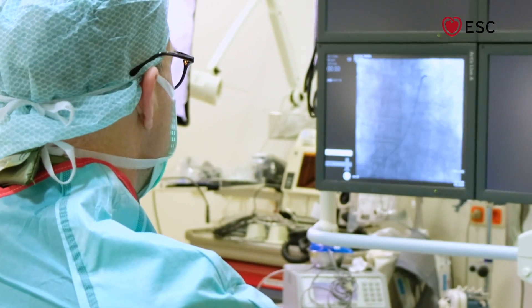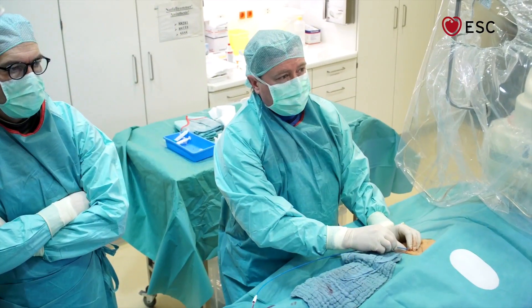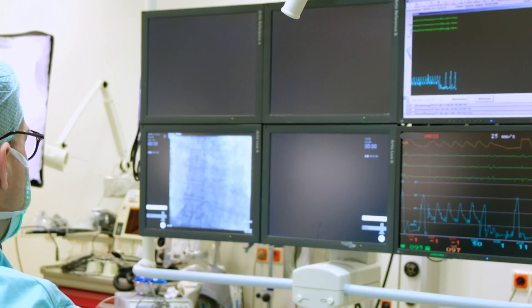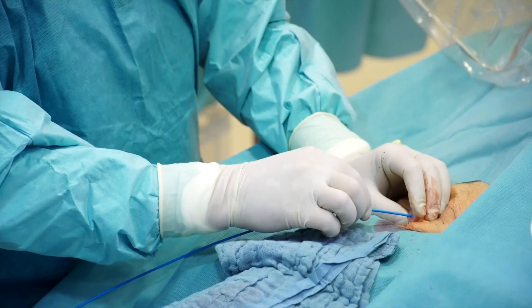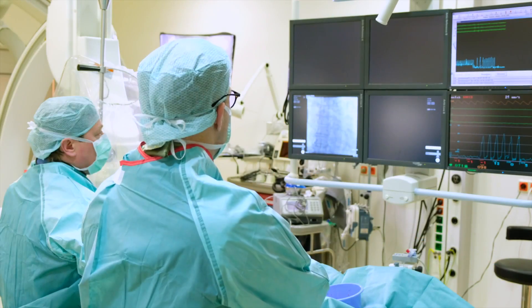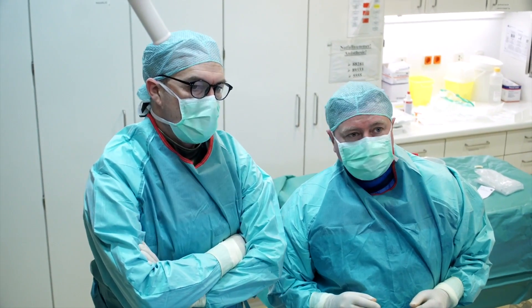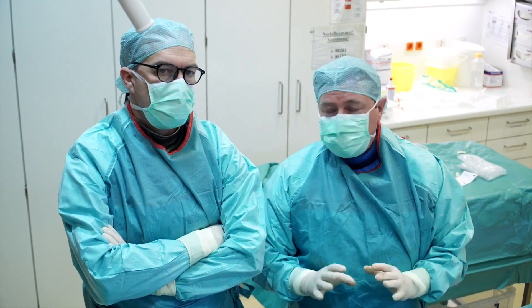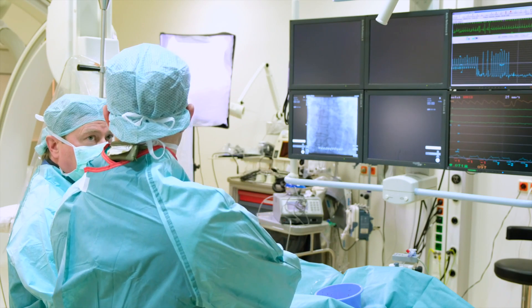Next, I pull back the catheter tip from the pulmonary artery into the right ventricle — you can recognize the change in the pressure curve from the PA pressure curve to the RV pressure curve. We then pull it further back from the RV into the right atrium, and we see the change from the RV pressure curve to the RA pressure curve. This analysis can be taken offline to measure any pressure gradients across the pulmonary valve, for example.